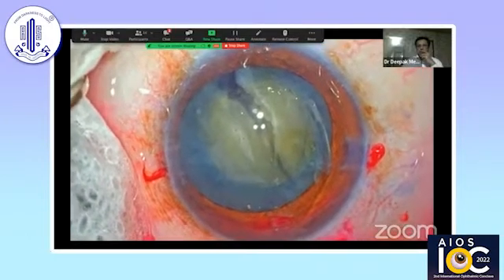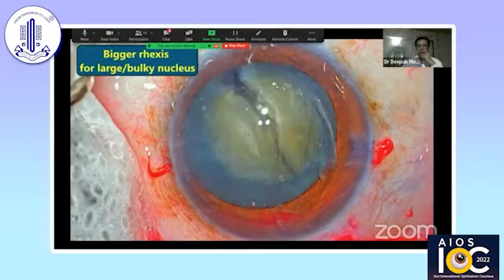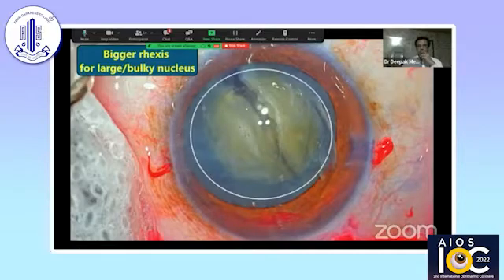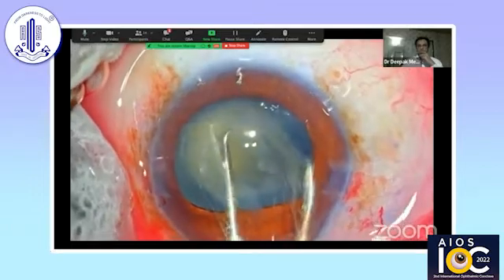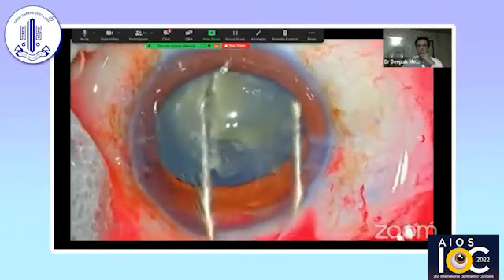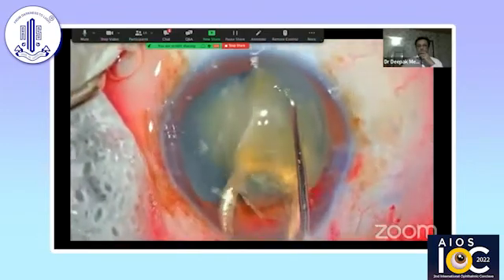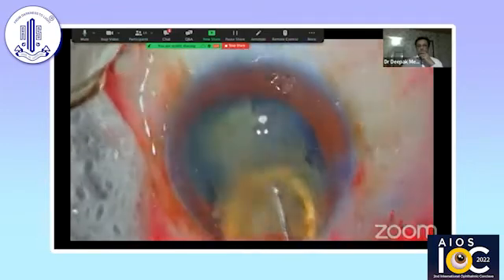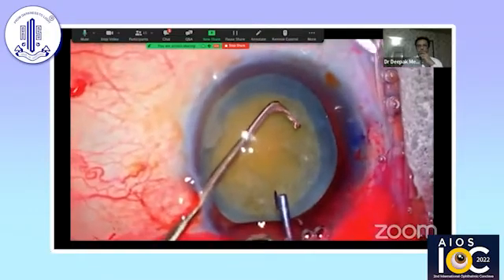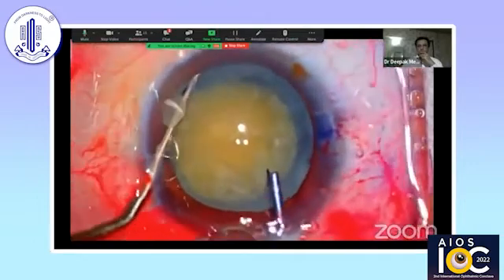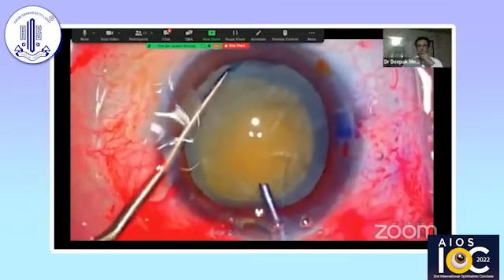Ideally, we want to have a five millimeter rhexis. Manipulating out can be tricky especially with a very large bulky nucleus — a bigger rhexis would be helpful. In a very soft cataract, removing soft fragments out of the bag is also challenging. The technique I use is two Sinskey hooks, then one pole of the hemi-nucleus is tipped out, and using the chopstick maneuver we support the fragment with these two Sinskey hooks, gently lifting it out of the bag and into the anterior chamber. The chopper is slid horizontally so the profile is horizontal, then slid under the anterior capsule until it reaches the equator of the nucleus, and rotated so it hooks the equator of the endonucleus.